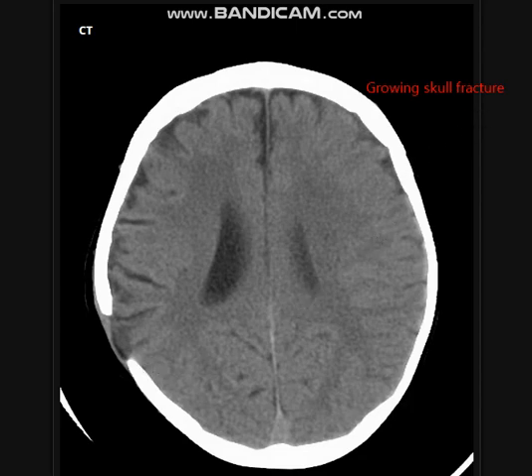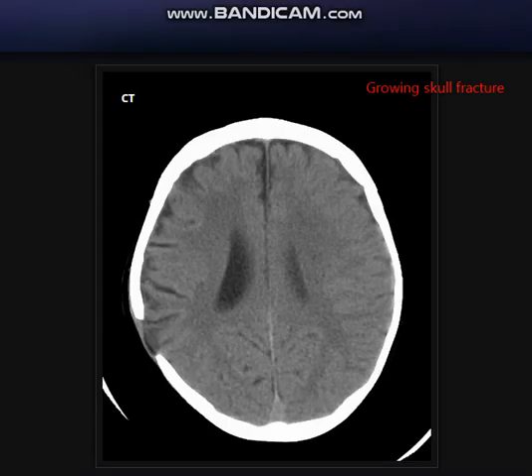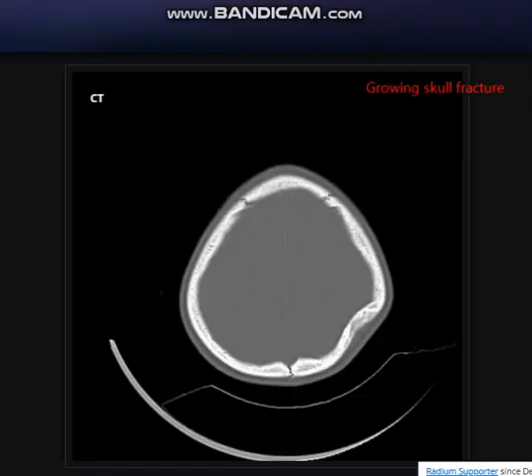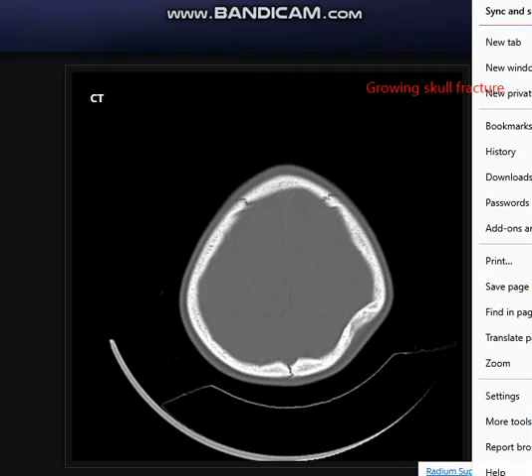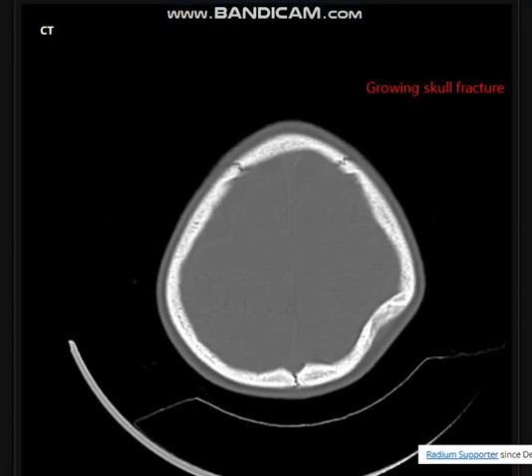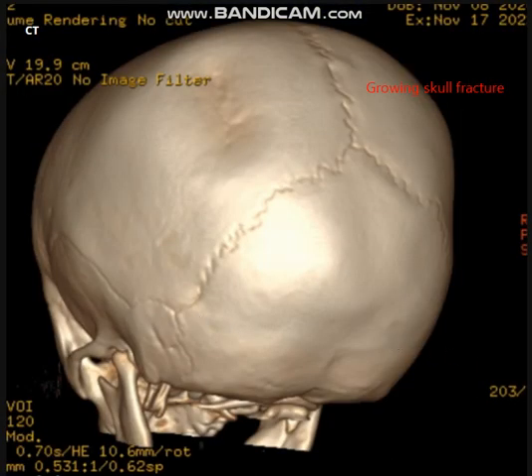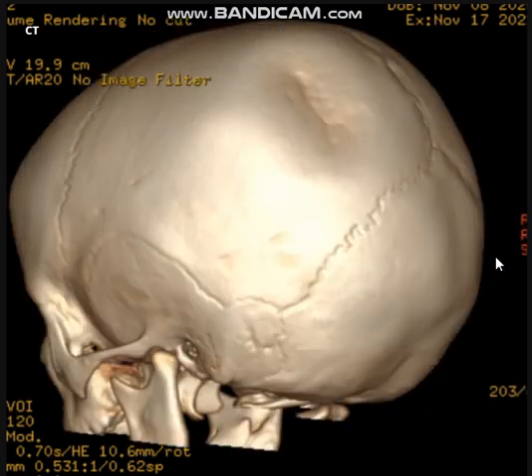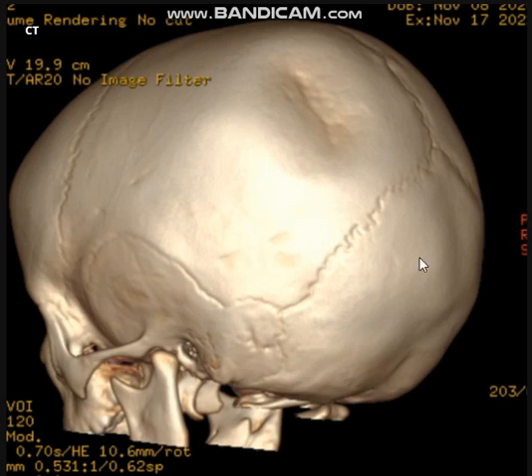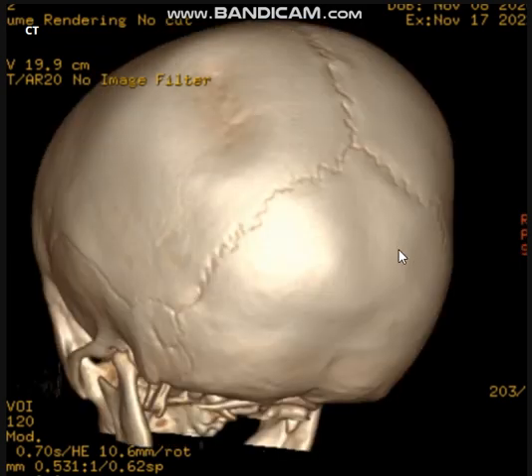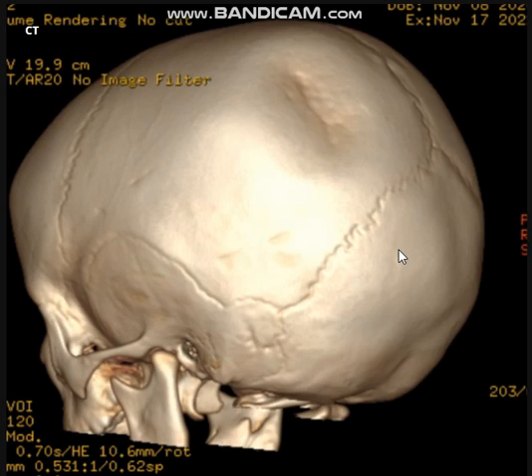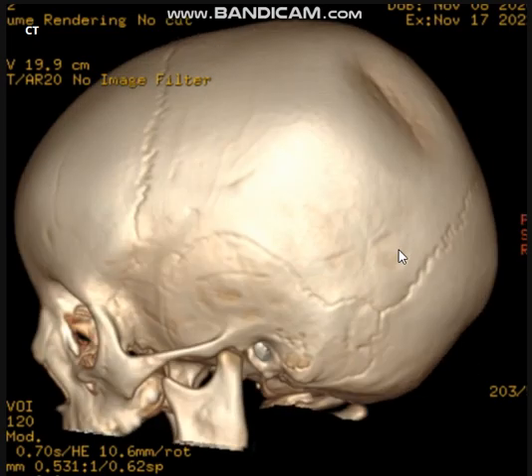We have another case here. This is a one-year-old boy who had a history of recent trauma, and his mother is complaining of indentation — she says she feels an indentation or deformity at the site of the trauma.